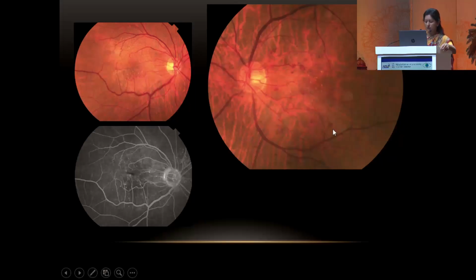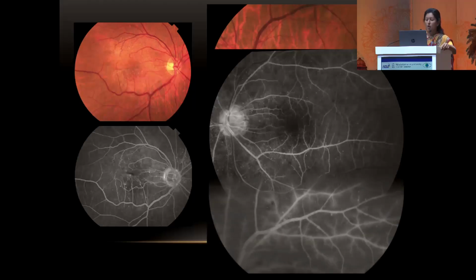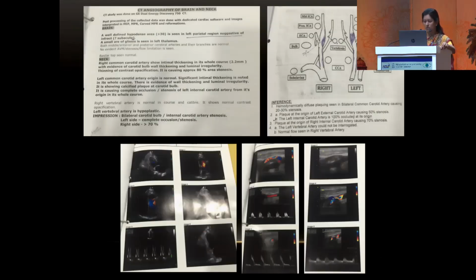These are deep retinal hemorrhages, and on FFA you see delayed filling. Along with this, typical small vessel telangiectasia and ischemia that you see in the periphery. Also mid-peripheral microaneurysms, especially if the patient is not a diabetic, these should alert you to the presence of venous stasis retinopathy or even early ocular ischemic syndrome.